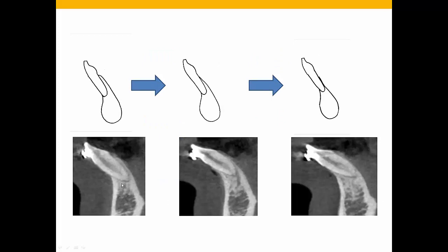Here's another example. If you look at the far left, you see that this is an orthodontic boundary violation from excessive class 2 elastic wear. You can see that the lingual bone still exists on the left, and as the tooth stays there over time, that bone resorbs and you get a tightening or adaptation of the lingual bone to the displaced tooth.